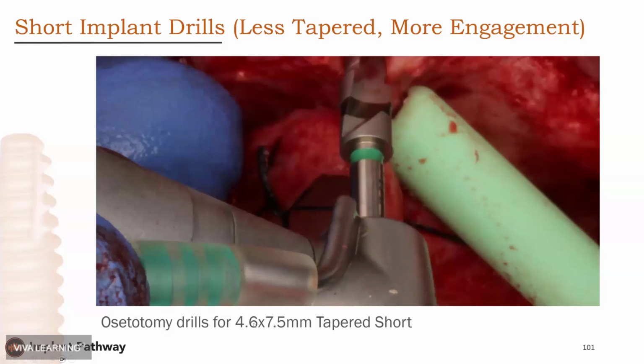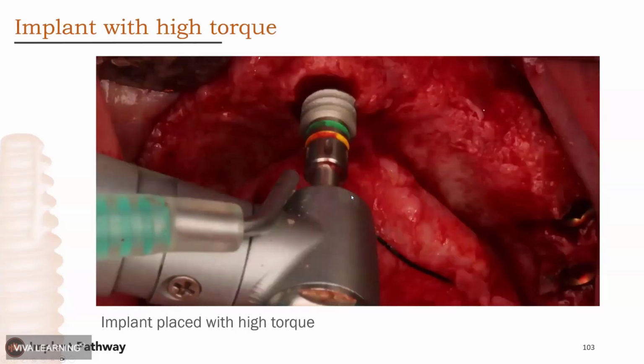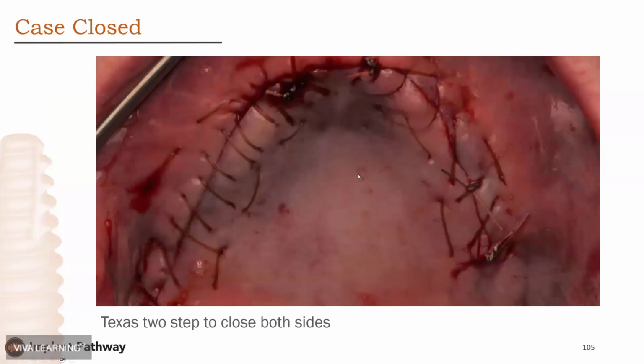And you can drill right into the nerve canal itself. And that's a lot of good, healthy, bleeding bone to place an implant. A good friend of mine, Dr. Bart Silverman, oral surgeon in New York, calls this God's osteotomy because it's very useful when you need it. Okay, implant goes in with a high torque, and the patient is closed.